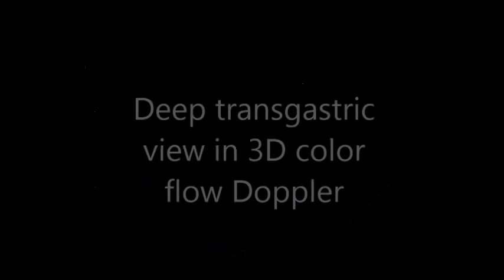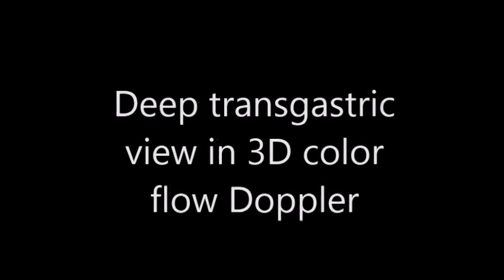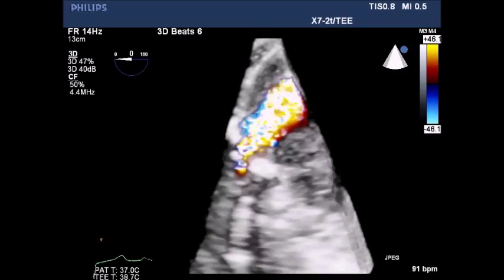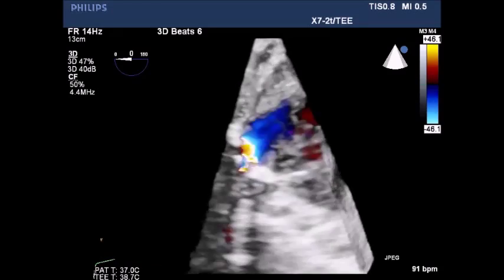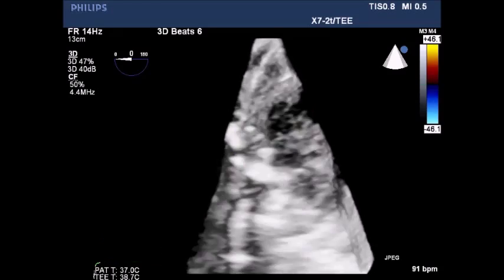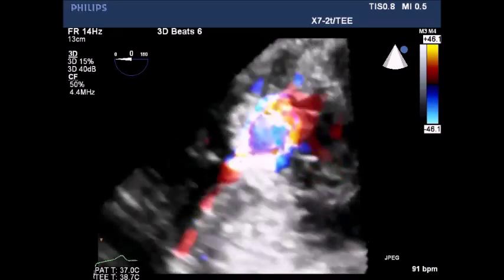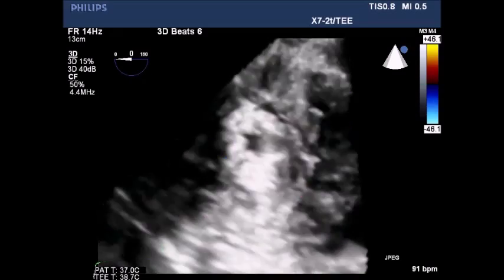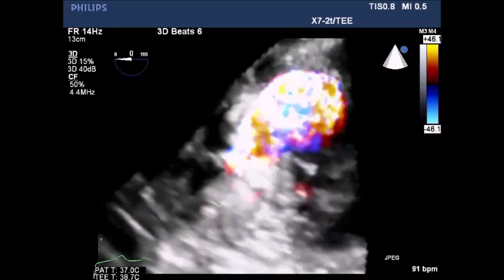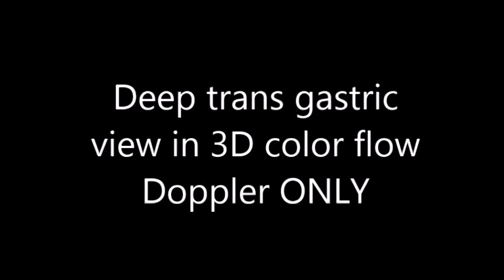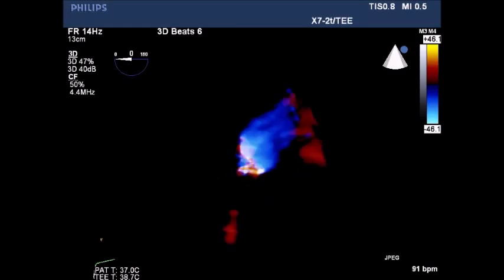Deep transgastric view on 3D color showing severe aortic insufficiency and a motionless aortic valve. Increasing transparency in the 2D elements — note again severe aortic insufficiency. Deep transgastric view without 2D images, showing just a color flow Doppler pattern.